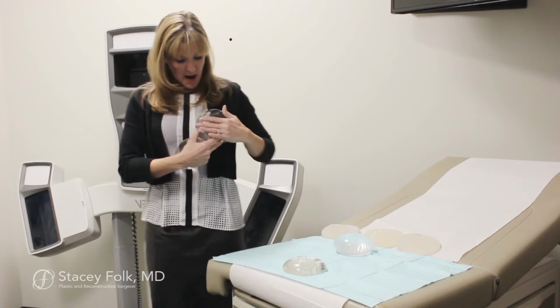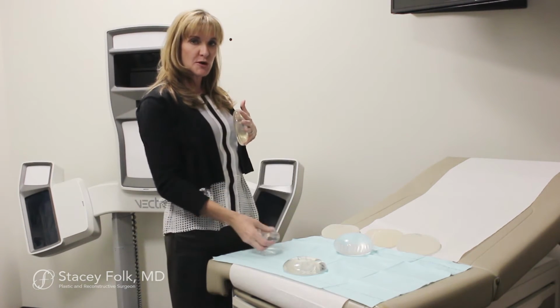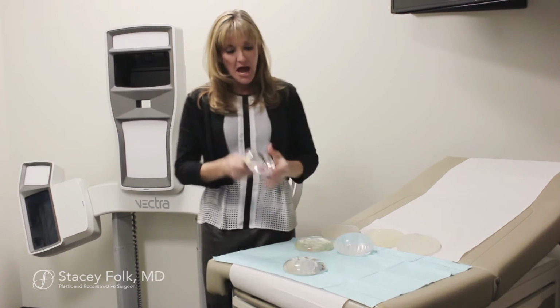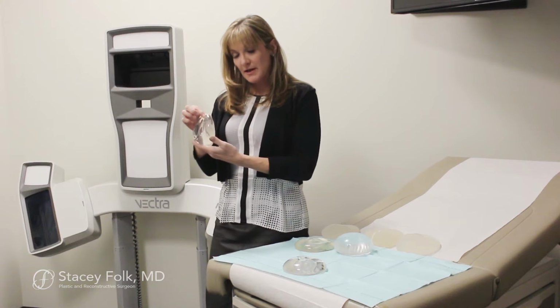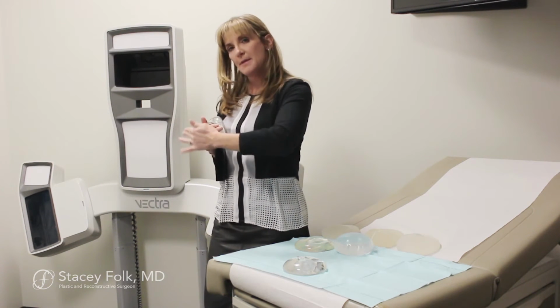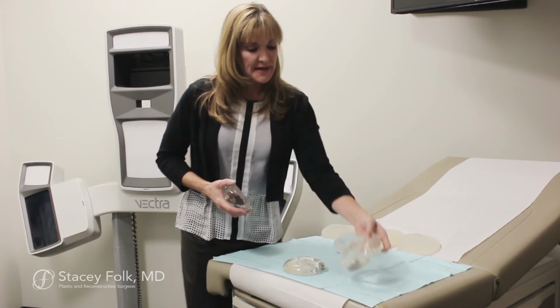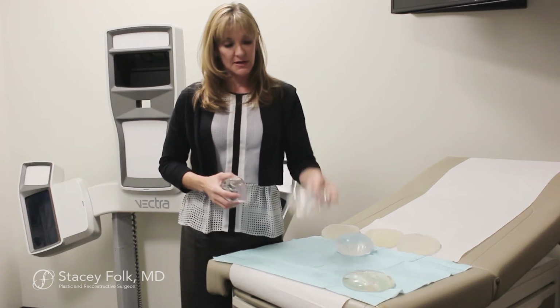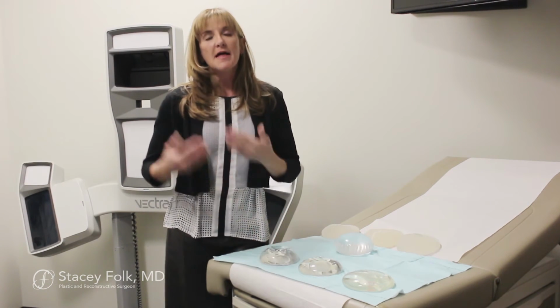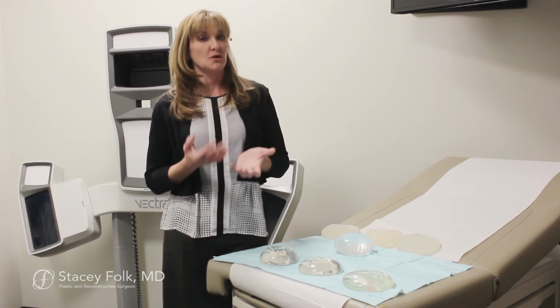So when a wider based implant is going to be inside someone, they're going to get more volume up here to the top, a more gradual slope, and not as much projection. An implant that's a high profile implant like this is going to have less volume at the top and then come out more lower. So we tend to pick, and we also have this one in the middle too. So we tend to pick the profile that fits the patient's anatomy based on the volume that they're looking for.